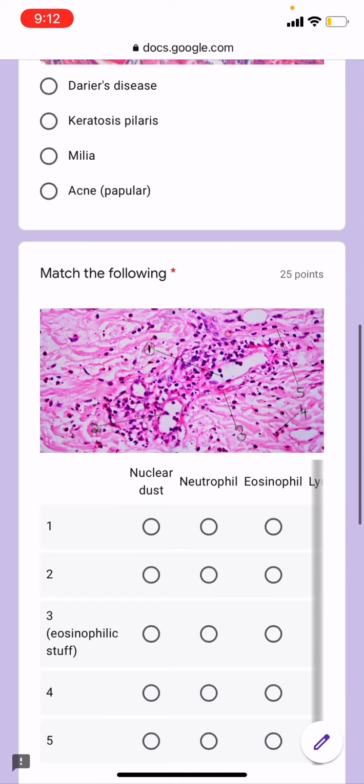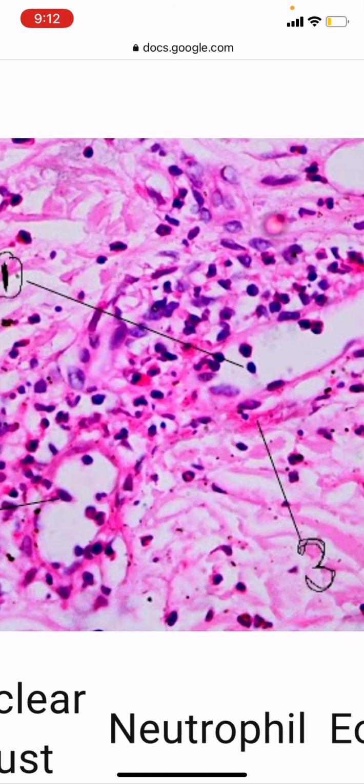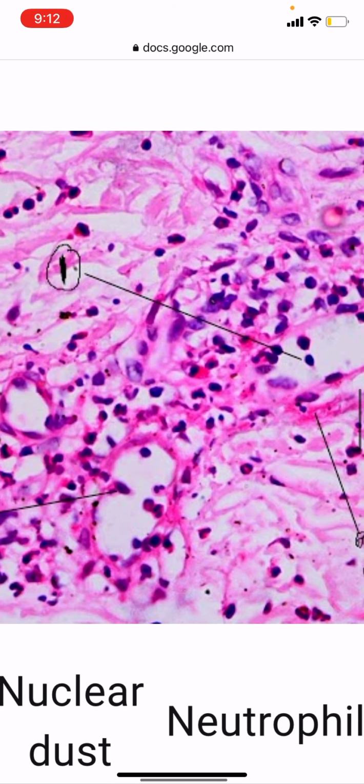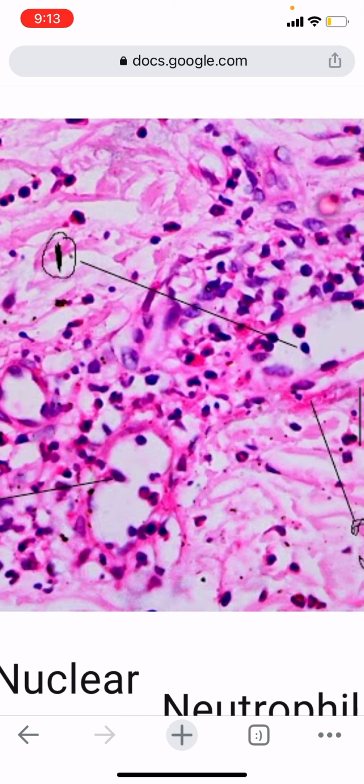All right. So the next picture shows basically a stage of vasculitis. What you're seeing here is fibrinoid vessel wall necrosis, which is labeled number 3. Number 1 is a lymphocyte with a round nucleus, no cytoplasm. Number 2 here is within the vessel wall lining. It is an endothelial cell. It's slightly darker stained than I would like it to be. Probably one of the other cells you might think about is a histiocyte, which may look like this, but again, there's no reason for histiocytes to be here. These are endothelial cells lining the vessel wall.